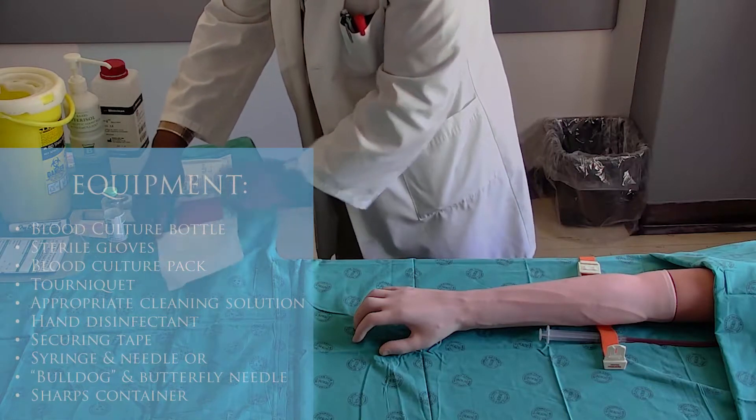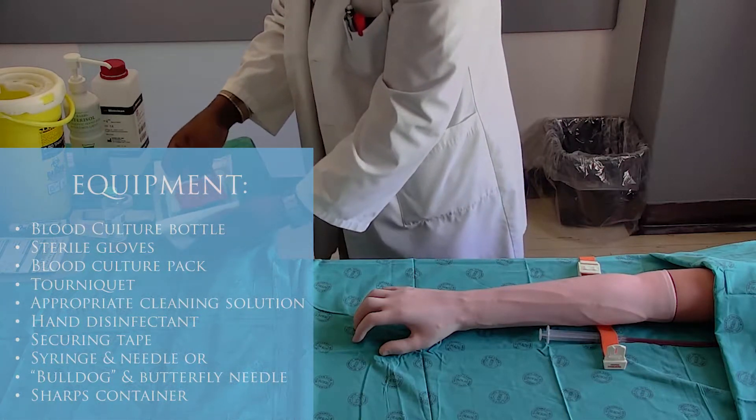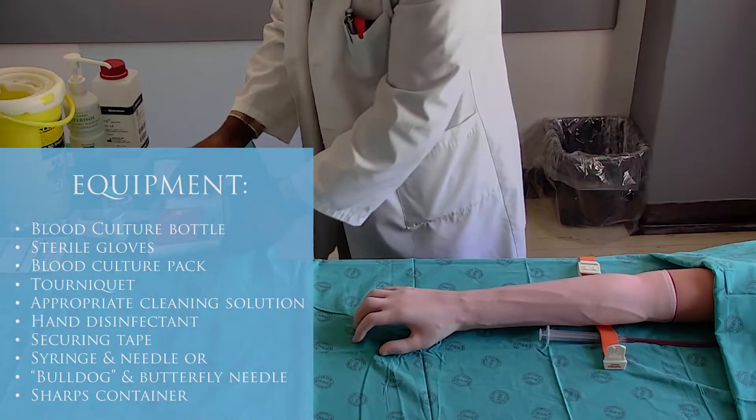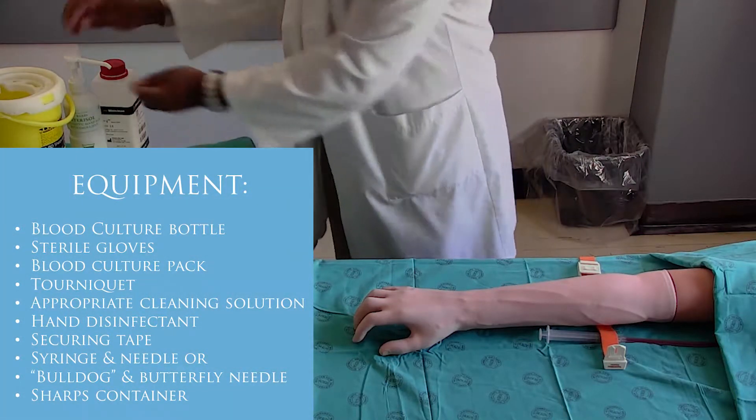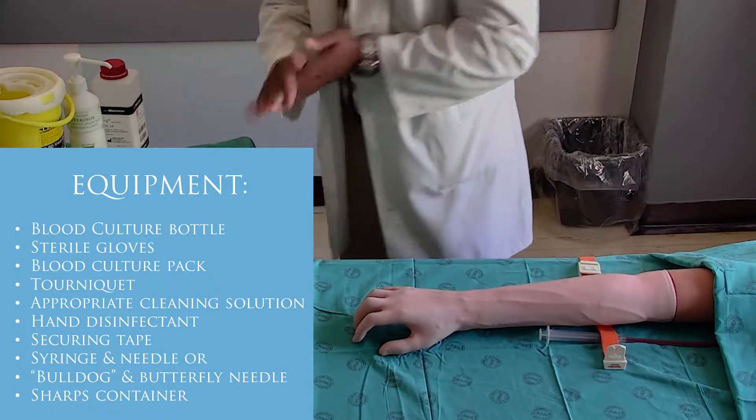Ensure that your equipment is ready. Open the blood culture sterile pack up and away from the trolley without lifting it. Disinfect your hands.